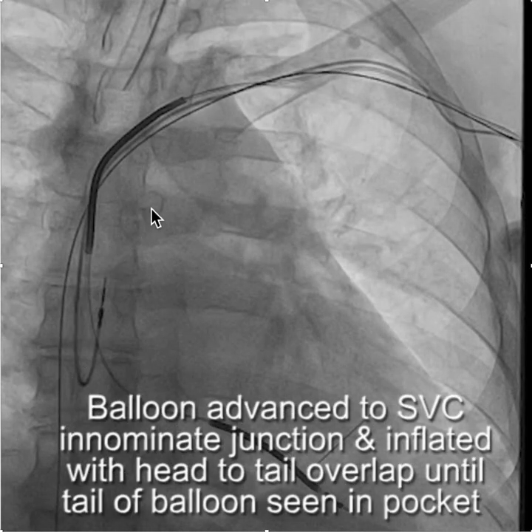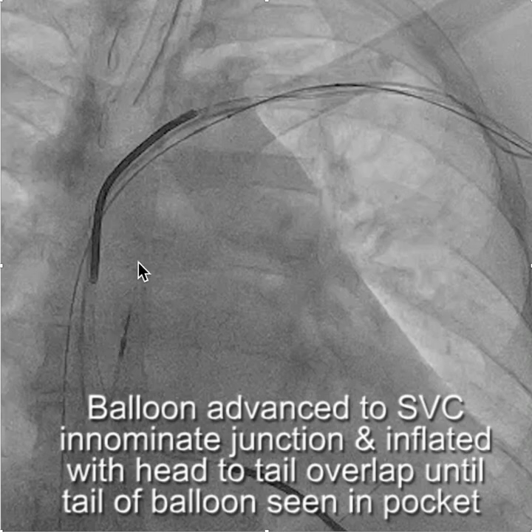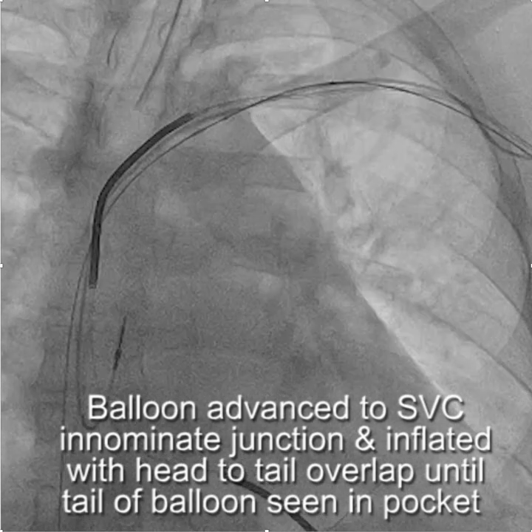The next step was to exchange the wire for an Amplatz No. 3.5 extra stiff wire using a braided hydrophilic catheter. Now we're advancing a balloon over the wire, and you can see there's a fair amount of resistance as we advance it.